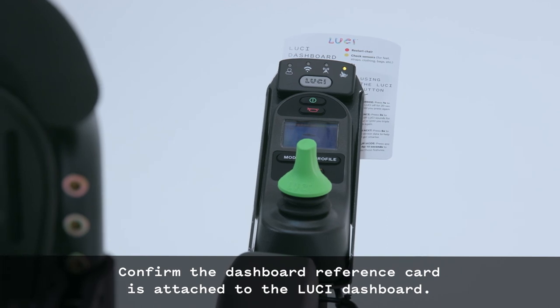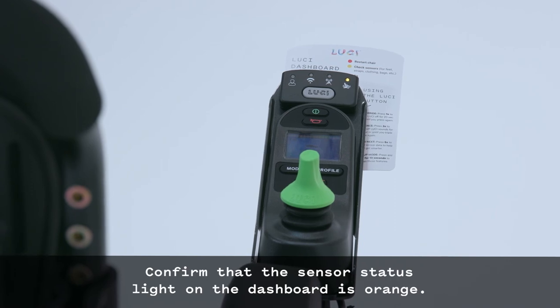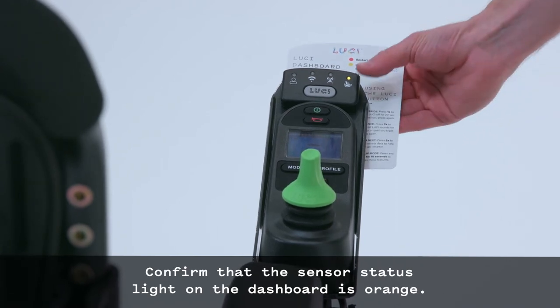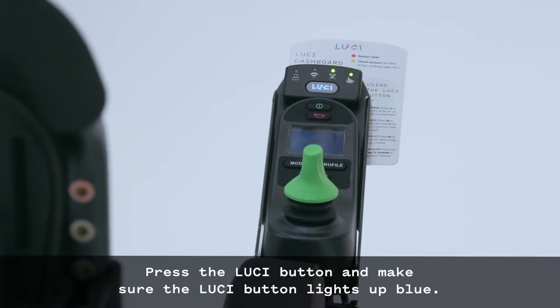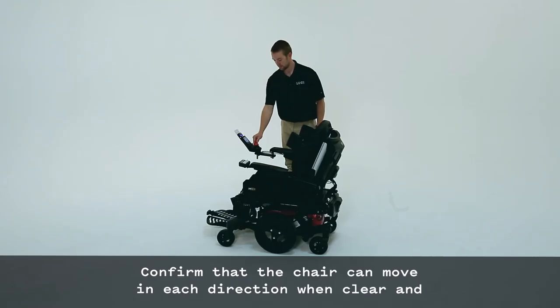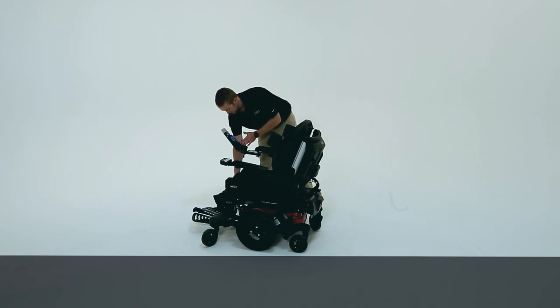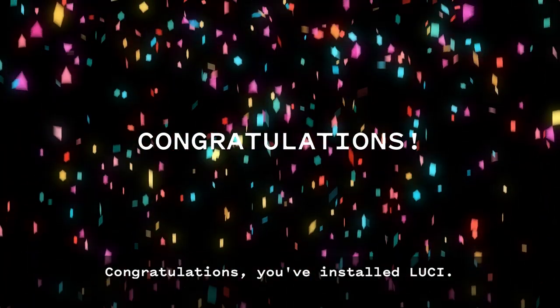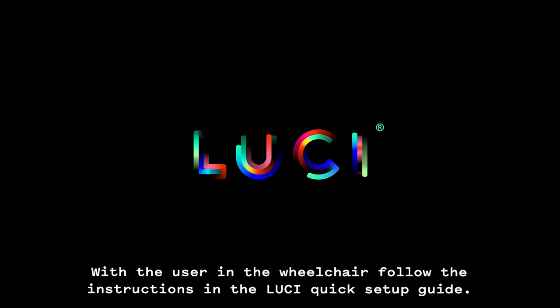Confirm the dashboard reference card is attached to the Lucy dashboard. Confirm that the sensor status light on the dashboard is orange. Press the Lucy button and make sure the Lucy button lights up blue. Confirm that the chair can move in each direction when clear and that the chair stops in a blocked direction of travel. Congratulations, you've installed Lucy. Before releasing the wheelchair to the user, the system will need to be configured. With the user in the wheelchair, follow the instructions in the Lucy Quick Setup Guide.